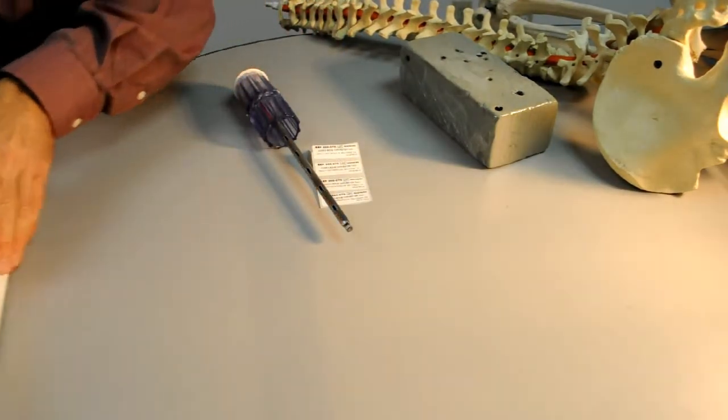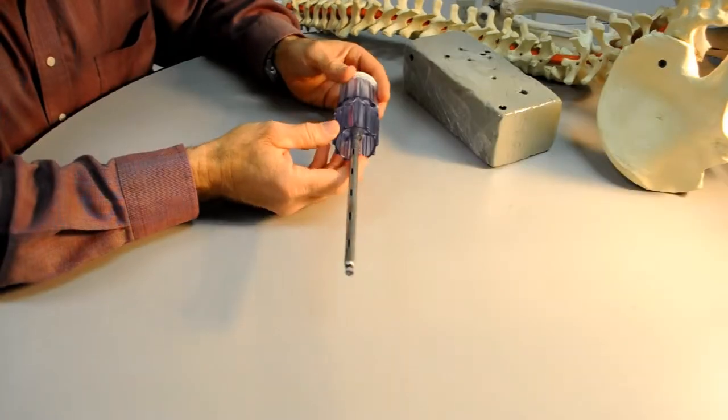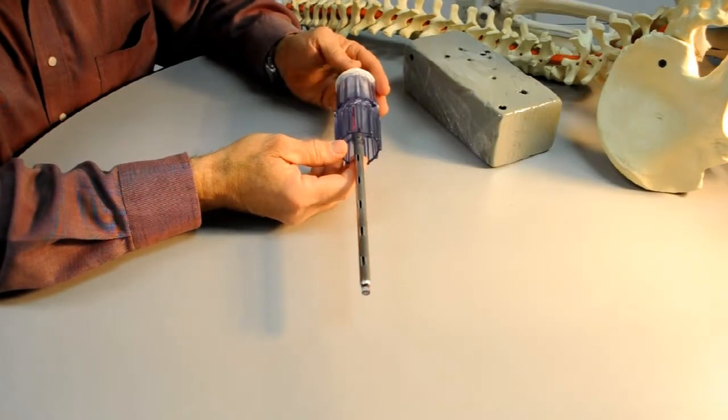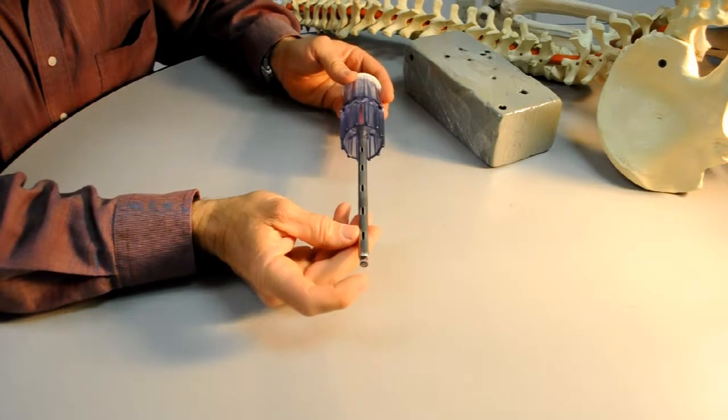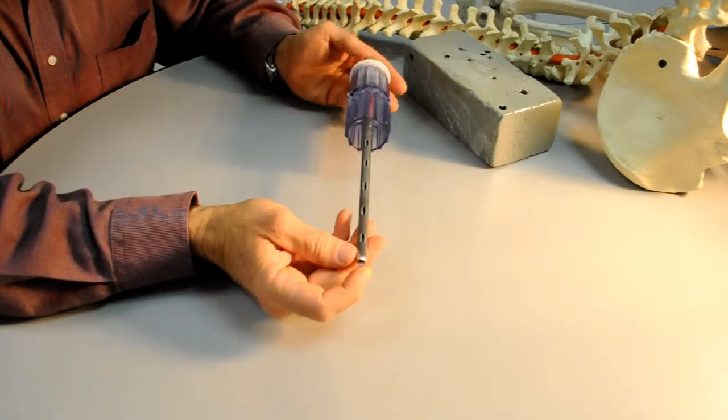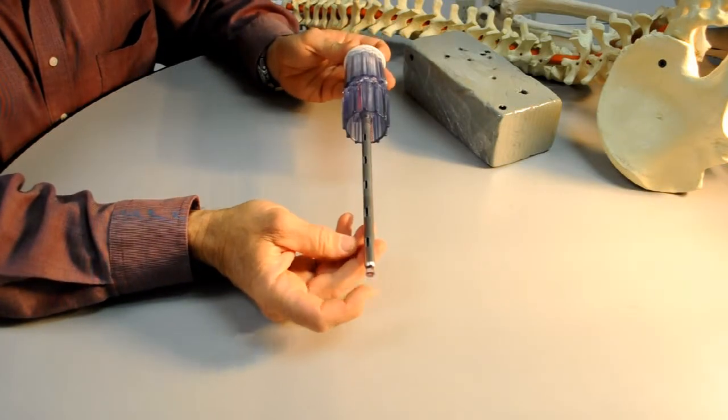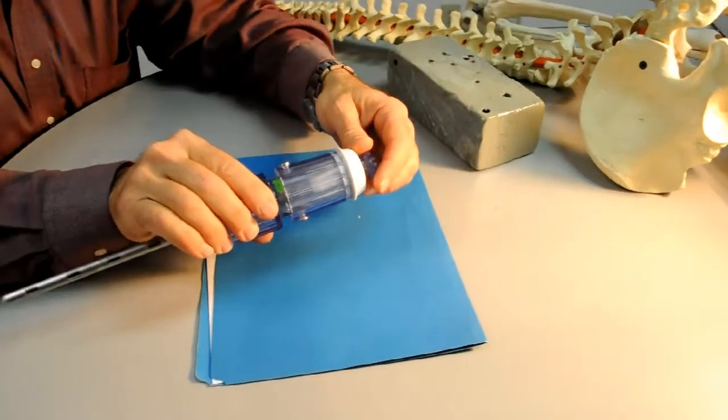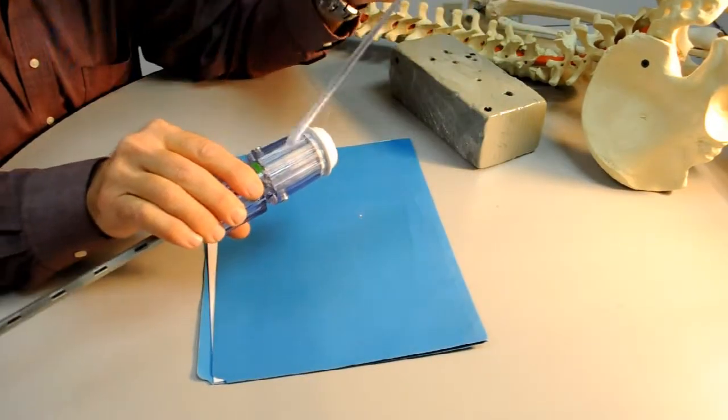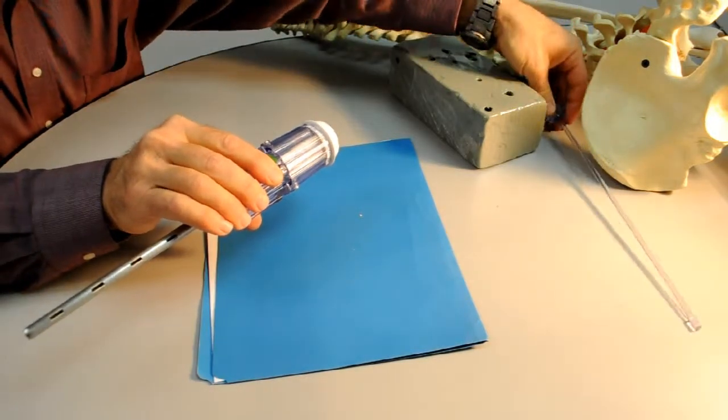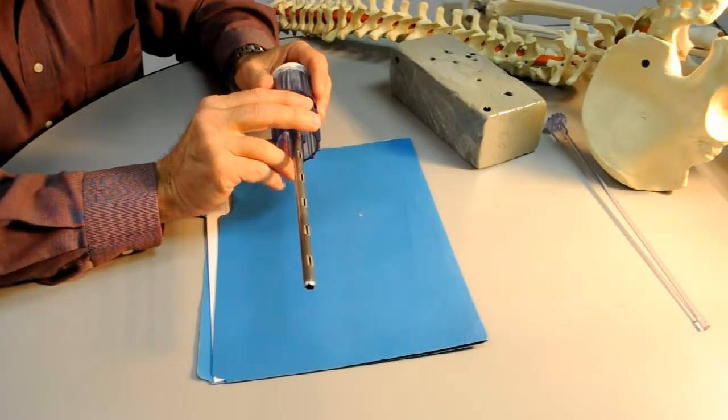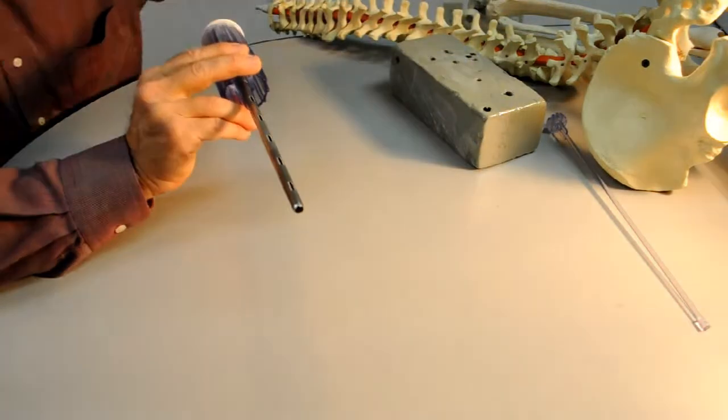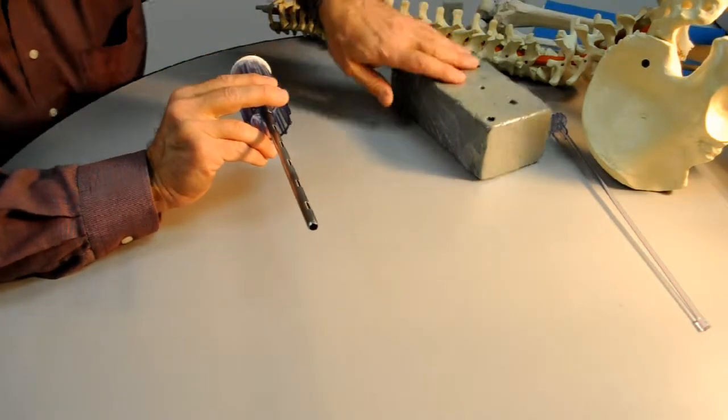Now I'm going to demonstrate the use of the device. After it's been delivered sterilely to the operative field, the extrusion or plunger plastic element is already contained within. The plunger is removed and carefully retained in the operative table area because it's important for extracting the cancellous bone from your harvest site.